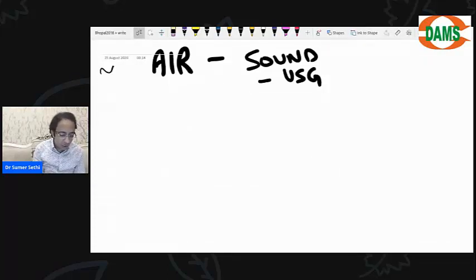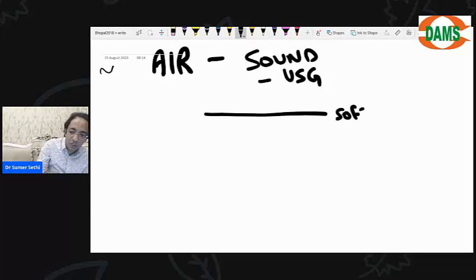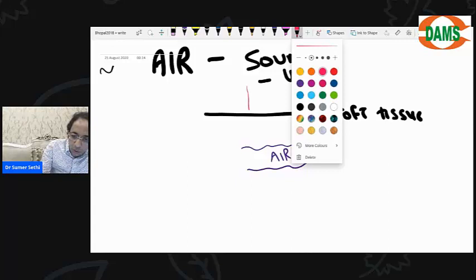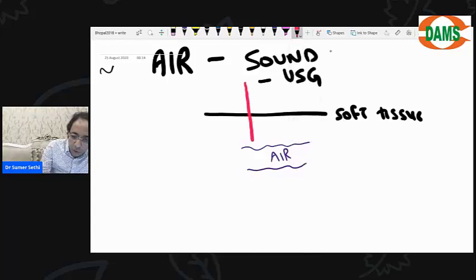Okay, now do you understand? आपको सबको transmit लग रहा है ना, धीरे पढ़ना है बेटा, धीरे मेरे साथ पढ़ना है. Now see this. If this is your soft tissue of your body, listen to me everybody, and this is an air filled structure like bowel. What happens in human body is different from what you are thinking. Sound beam goes into your body through the soft tissue to an air filled structure.